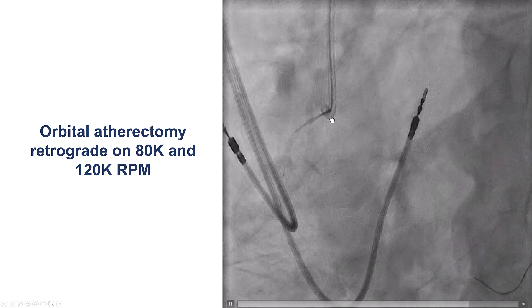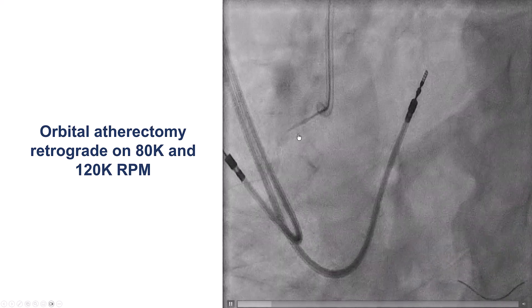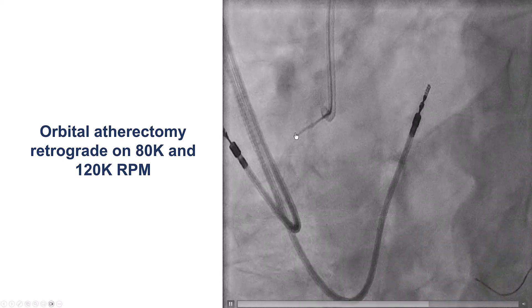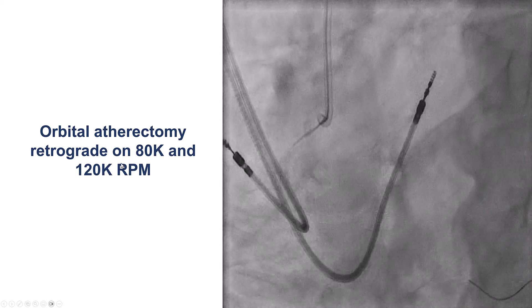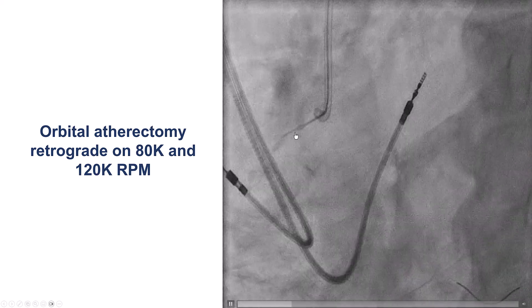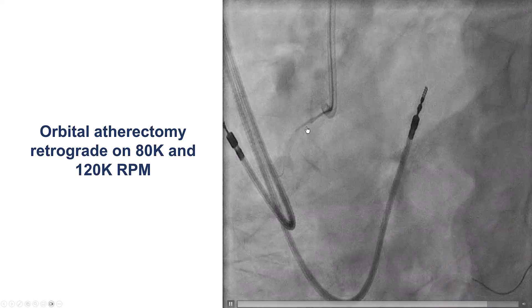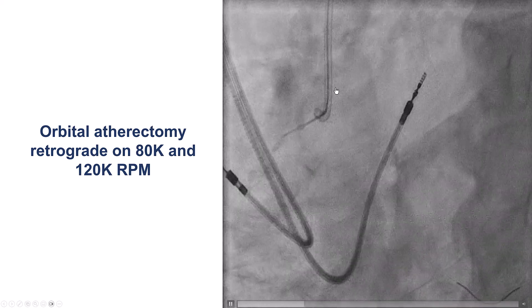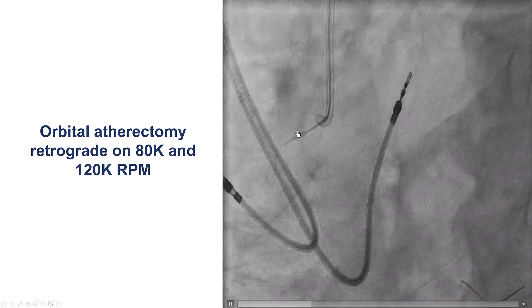The way we performed orbital atherectomy in this case was by going backwards. We used the glide assist to go forward inside the right coronary artery, and then came back at 80,000 RPM. Because this is a large vessel, we also went to high speed at 120,000 RPM, which is something we do very rarely. We could have also used rotational atherectomy here. With orbital atherectomy, it is better to do this backward treatment rather than forward treatment, which can cause dissections due to the large radius of spinning of the crown.